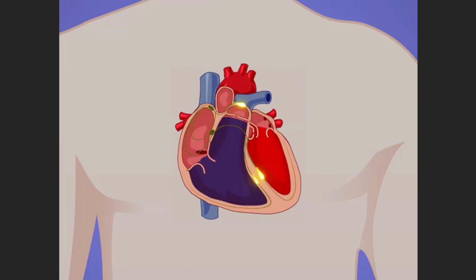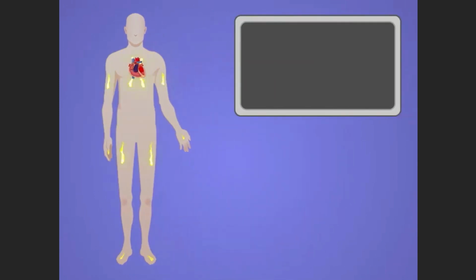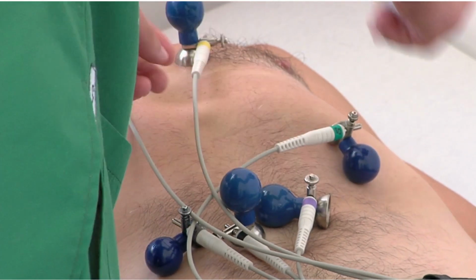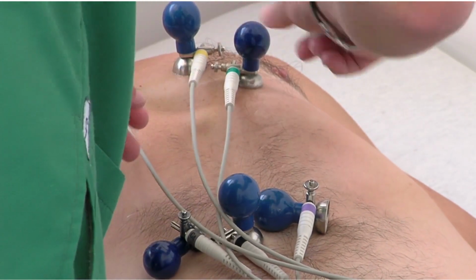Electrical signals are produced by contraction in heart walls, which drive electric currents and create different potentials throughout the body. By placing electrodes on the skin, one can detect and record this electrical activity. In a practical scenario, different electrodes are placed on different parts of the patient's body.